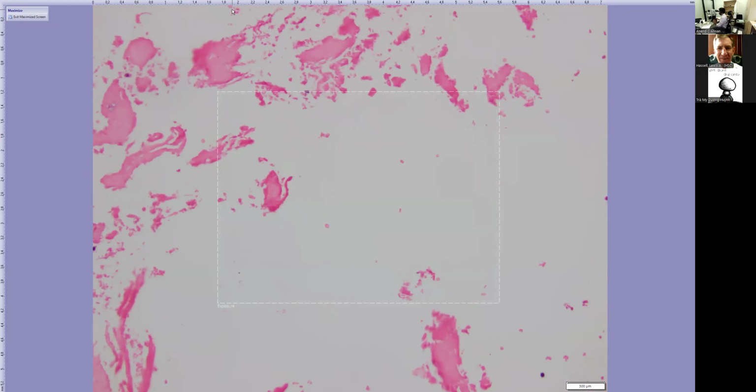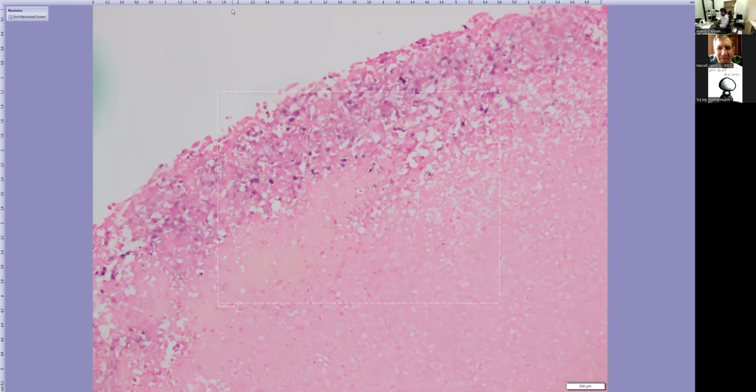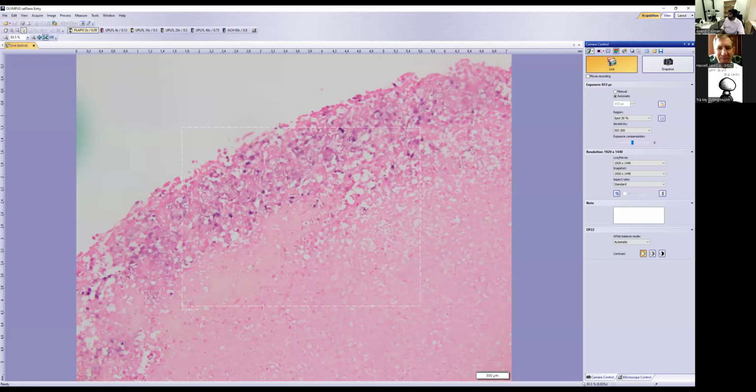So it is subset patchy positive in those large cells. So this is the workup that we did. So it is an EBV positive large B-cell lymphoma. So the differential at that point was a diffuse large B-cell lymphoma with EBV expression. That is a separate WHO entity, which is EBV positive diffuse large B-cell lymphoma.